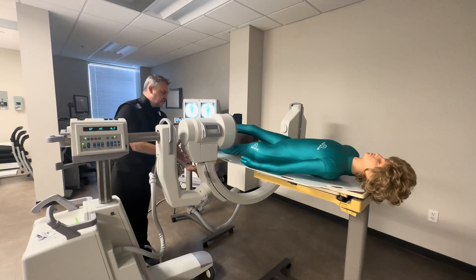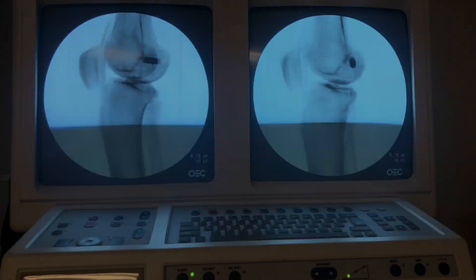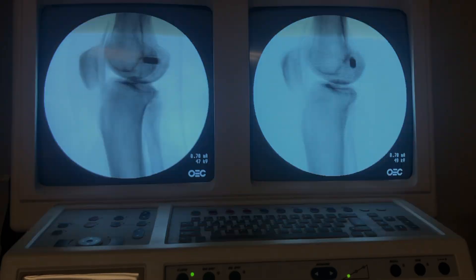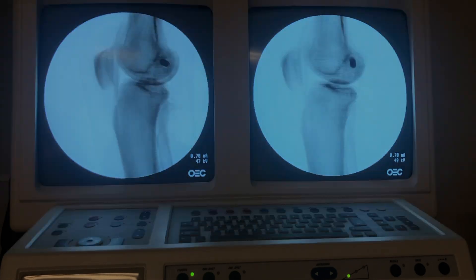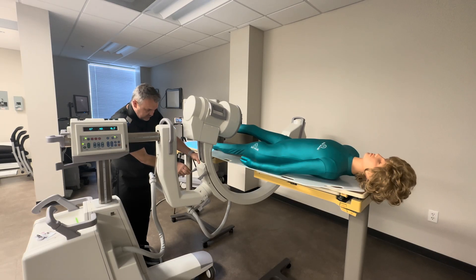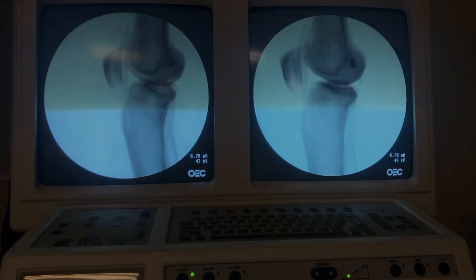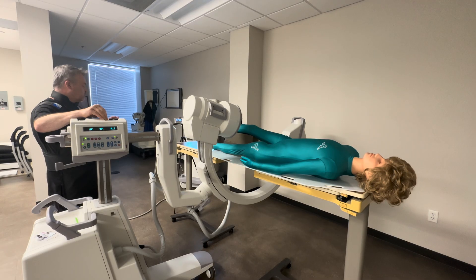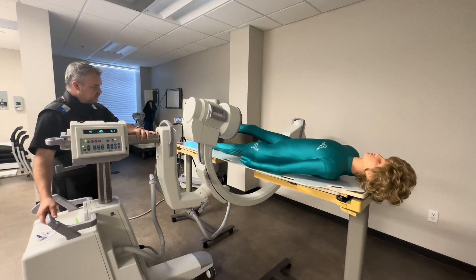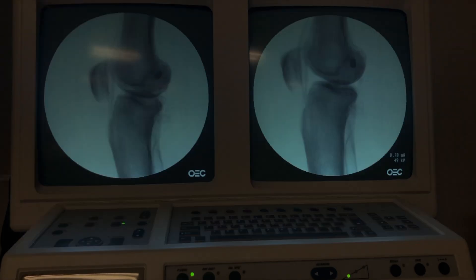Let me go ahead and apply my rotation. I have anterior-posterior misalignment, so that will be a rotation issue. I'm going to come up 10 degrees and see if the image is better or worse — it's better, those condyles are definitely closer together. I'll add another five degrees; it does improve it, but my anatomy shifted. So I correct my height — I'm anterior, so my central ray needs to drop — and I also slide proximal to bring that joint in line with the central ray.